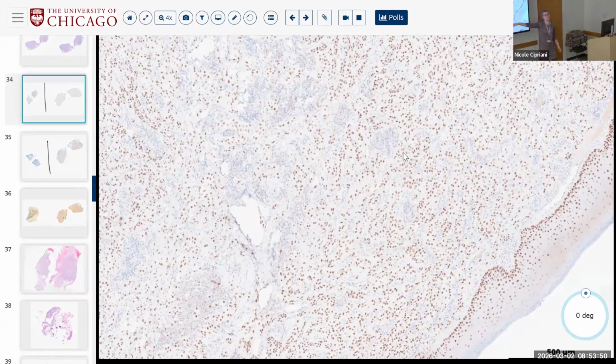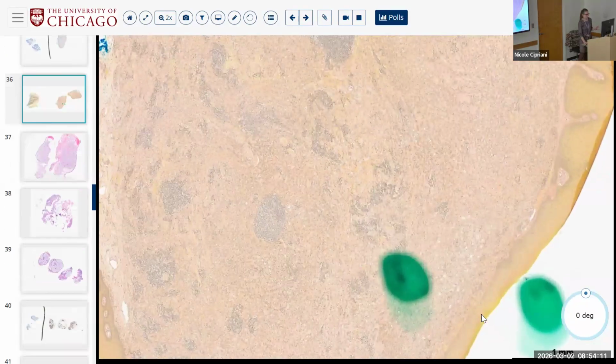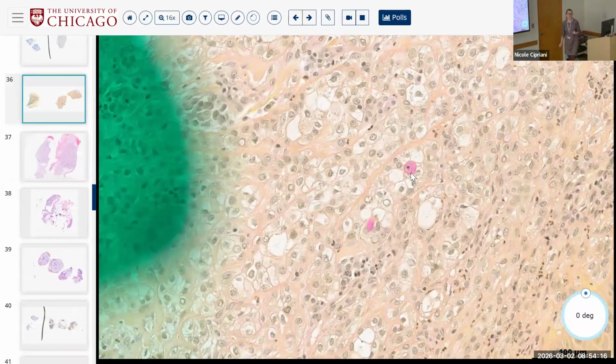So in this case, SMA, calponin, S100, SOX10 are negative. Now, that would also be true for mucoep. Mucoep should also be negative for those additional myoepithelial markers. So maybe you want to look at a mucin stain. I think we saw one intracellular mucocyte, right? So we're like, all right, is this a low-grade, is this a solid mucoep, or is this an HCCC?